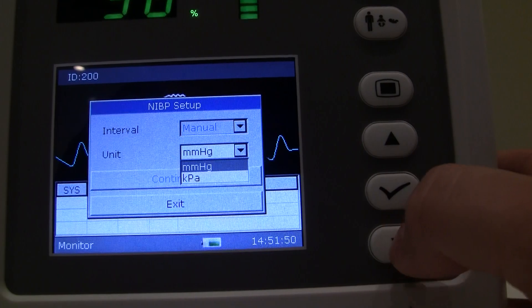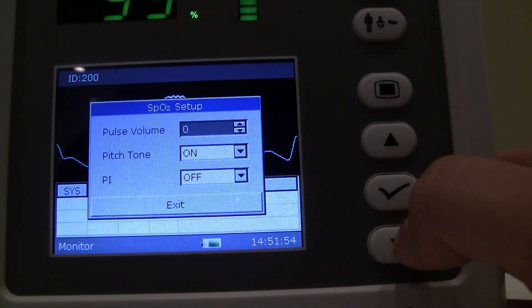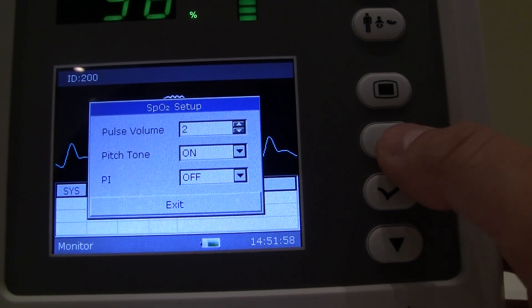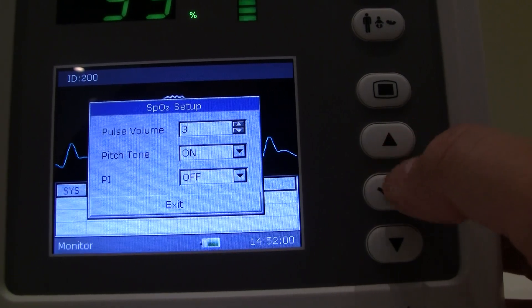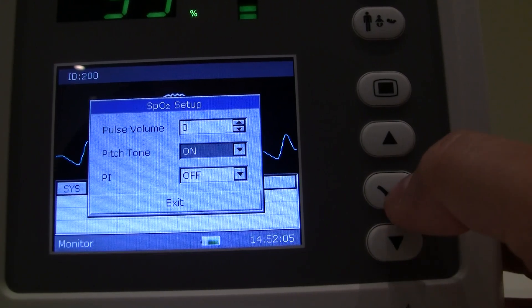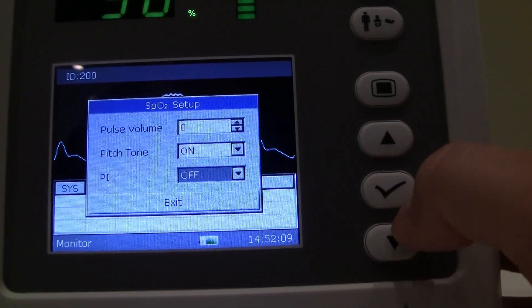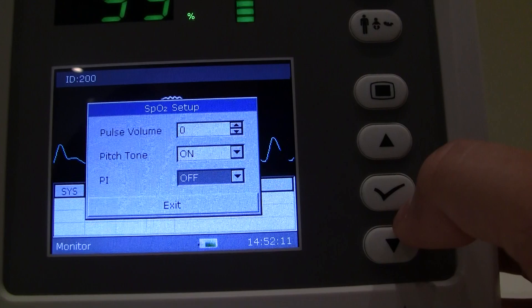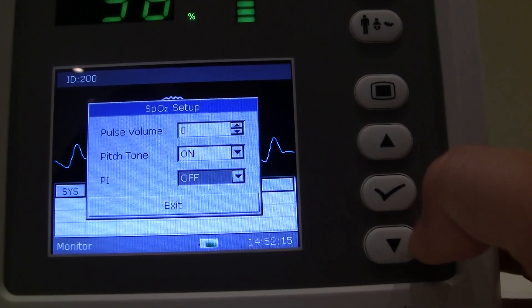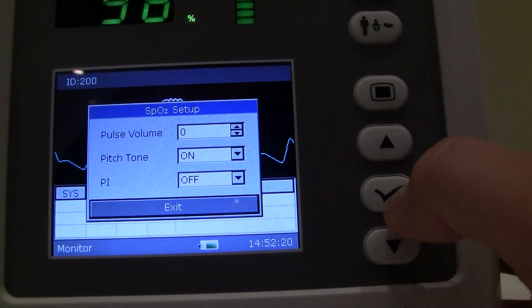NIBP setup is where you change those settings. In SPO2 setup, pulse volume is currently turned down to zero — if you turn it up you can hear it. Pitch tone can be turned on or off. Most people like to have it on so that if pulse rate and SPO2 levels go up, the pitch tone increases, and if they drop, the tone gets lower and longer.